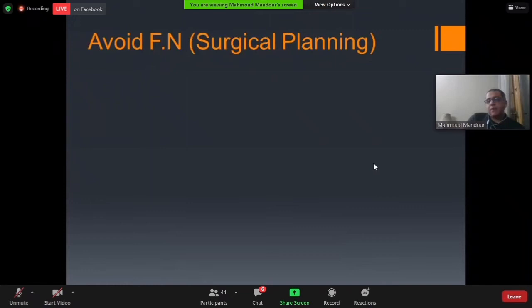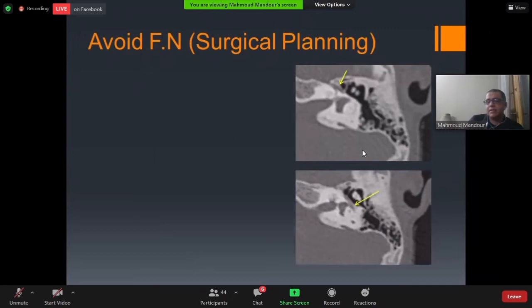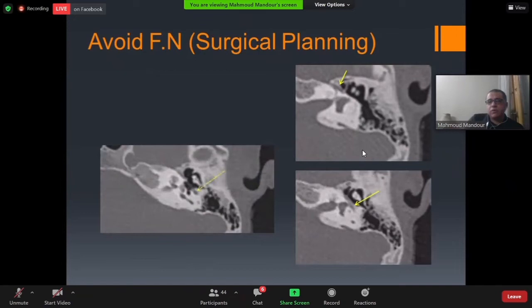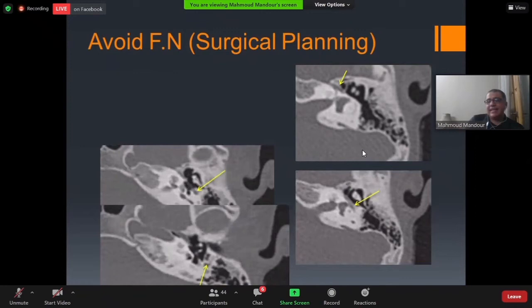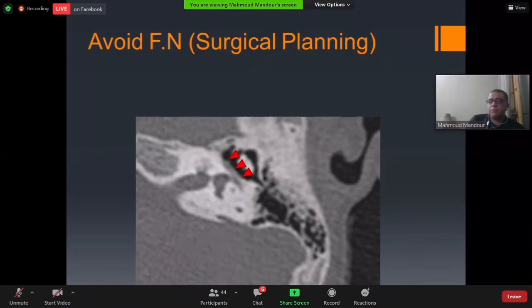For surgical planning to avoid facial nerve injury: trace the facial nerve starting with the labyrinthine segment, then the tympanic segment — ensuring the tympanic segment has an intact bony canal — then move downward to properly locate the mastoid segment in its vertical part of the fallopian canal. Axial cuts are much more honest and beneficial than coronal cuts for this evaluation.